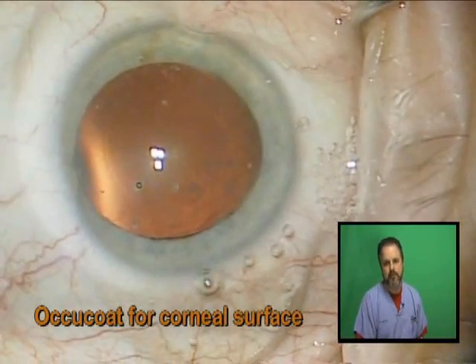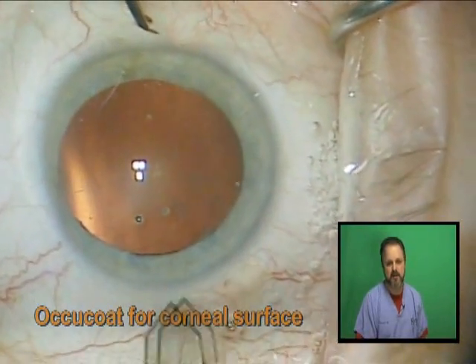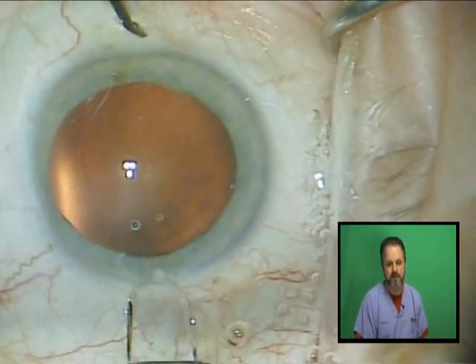When I start the case I like to put some OccuCoat viscoelastic on the surface of the cornea. I find this moisturizes it for almost the entire case.